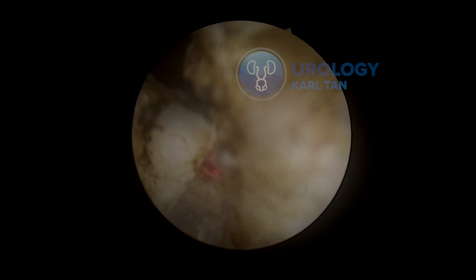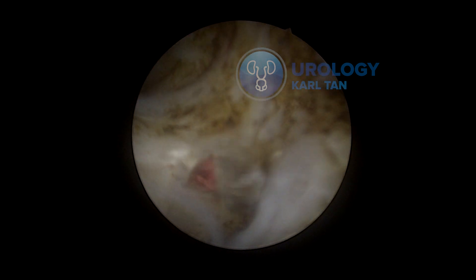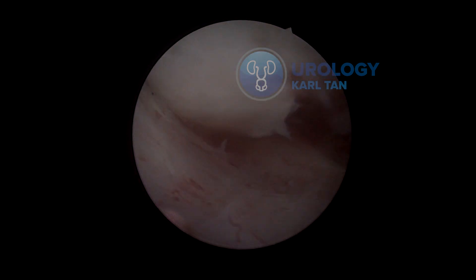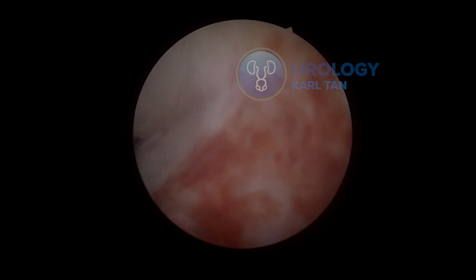Along the way, when I encounter bleeders, I would control them. One of the keys to doing a good post-enucleation morcellation is a clear view. Right now I'm focusing on releasing the posterior part. We're at the median lobe already, trying to release the sticky part using some blunt mechanical dissection to release the median lobe.